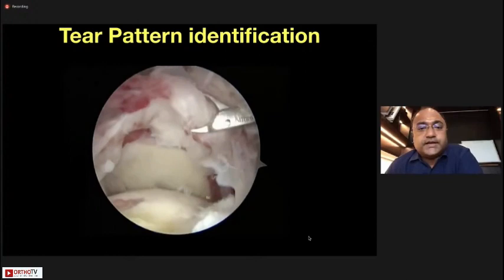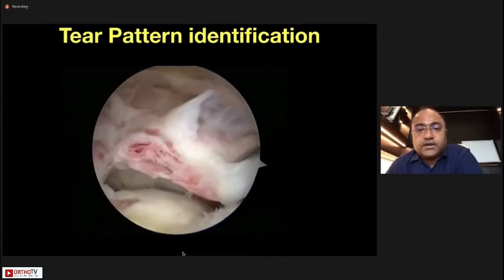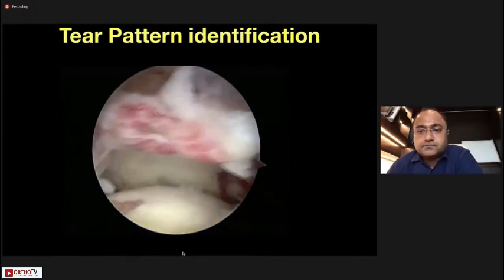Now coming to tear pattern identification — the first thing you do is identify the tear pattern. This appeared to be an irreparable tear, so I start doing my releases. This is an important take-home message: not only in this case but in all cases, make sure you create a low-tension repair, otherwise you will have a re-tear.